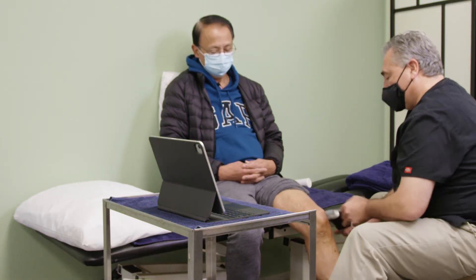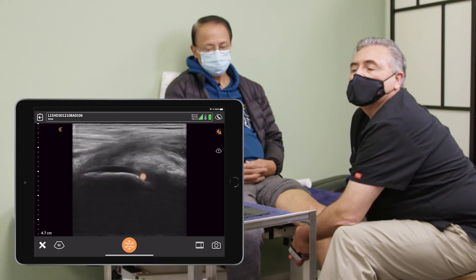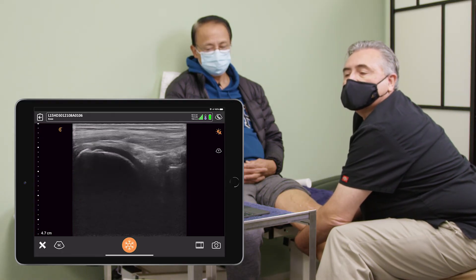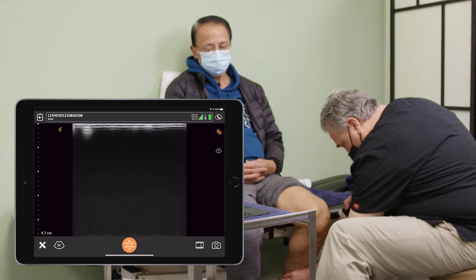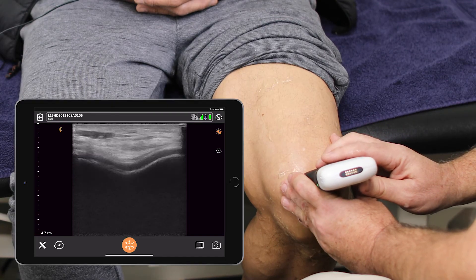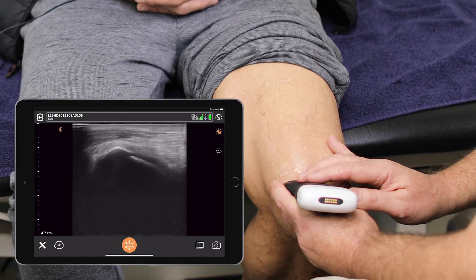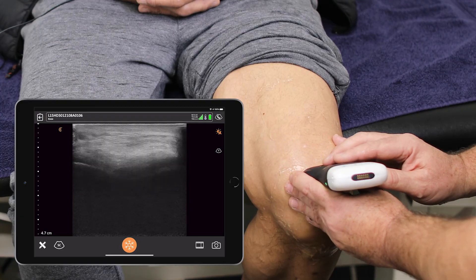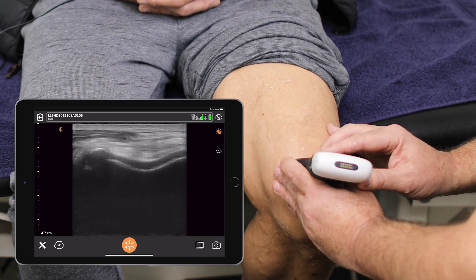I'm going to go one more time to the back. I'm looking right now at cartilage thickness on the back of the medial condyle, and I'm looking at the tibia for any type of bony formation. This is the cartilage thickness on the lateral condyle — I just can't attribute that to osteoarthritis. We're going to bend that knee back a little bit further and hold it just like that. This is the cartilage in the trochlear groove. I'm seeing a unique elevation along the medial slope — a little bit of periosteal spurring there. But looking at the actual structure, I am not seeing evidence that I would be thinking this guy needs a new knee.